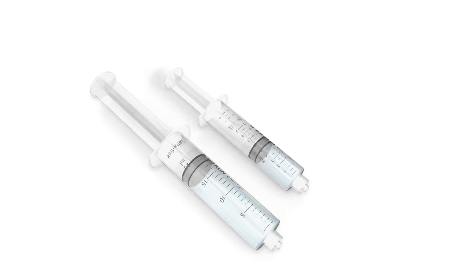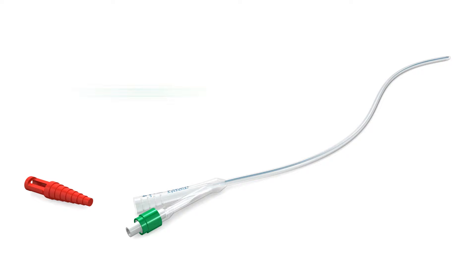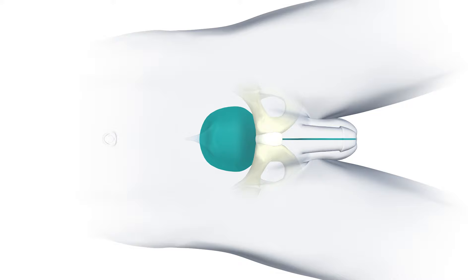During the preparation phase, fill two syringes: one for anesthetic injection and another for the balloon inflation if a silicone balloon catheter is used. The red spigot or a urine bag is connected to the catheter.